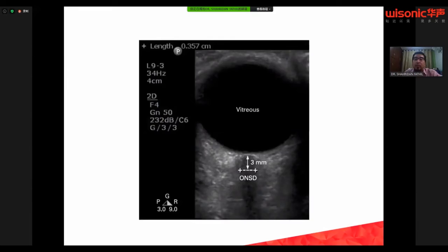For example, the one that I showed you earlier, in pediatric patients, where you can diagnose possible raised ICP. Of course, in a tertiary hospital, it's probably not so important because you can easily get a CT scan done. But imagine this is quite helpful in a resource-limited environment.